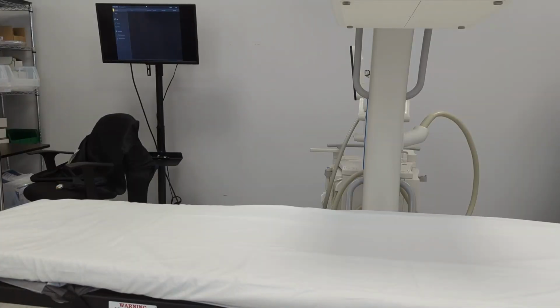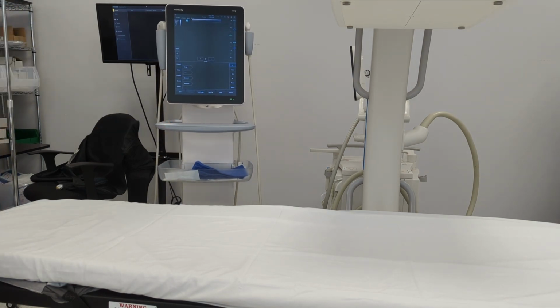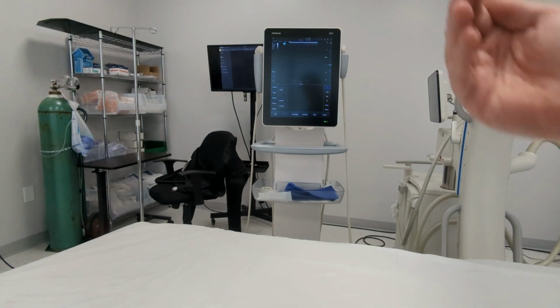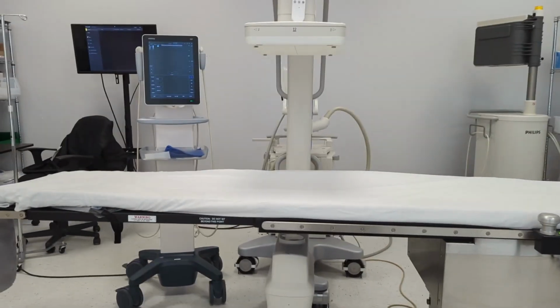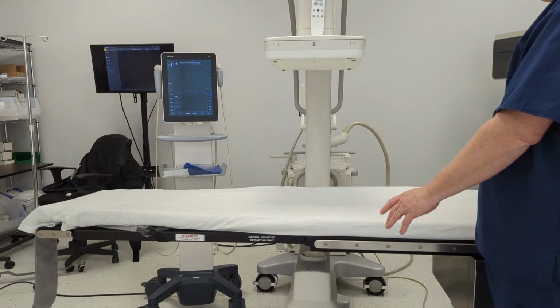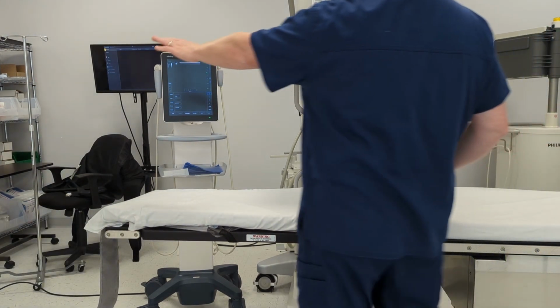And now that the camera is in place and the patient is prepped, I'll bring in the ultrasound machine. I have room to pan the patient up above the intensifier so that we can work with the ultrasound. When we use the ultrasound to access the artery, I will pan the patient up so the doctor has full view of the screen, and when it is time to use the x-ray, I will pan the patient back down.